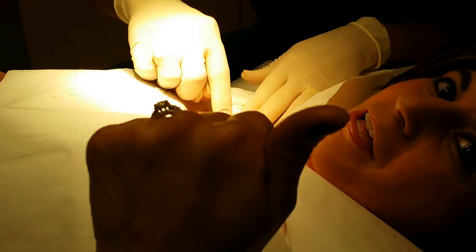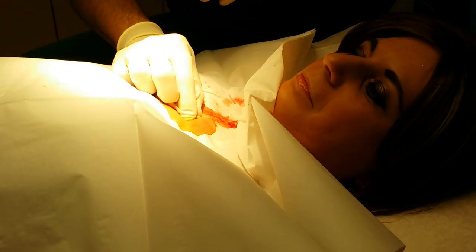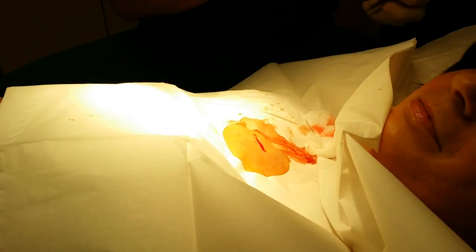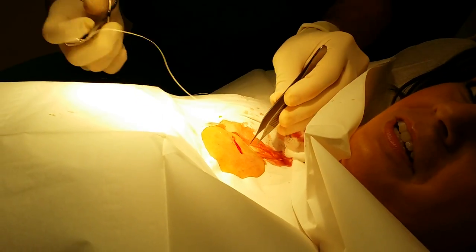All done. No bleeding — everything looks fine. Now we're just going to close that same scar. It's much easier to take it out than to put it in, yes.